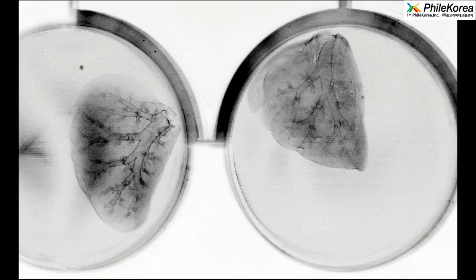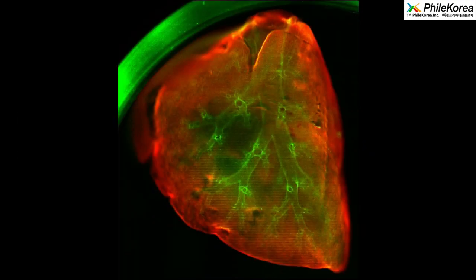Look at this. This is an image which shows you the signal from the inside. This is the 800 channel signal, which is penetrating the tissue, and the red signal, this is the 488 laser, which is of course just hitting the surface. So you can do these nice overlays to look inside, and you see also the structure in the front.